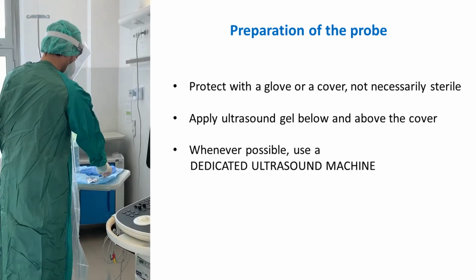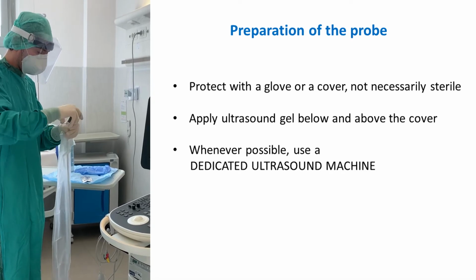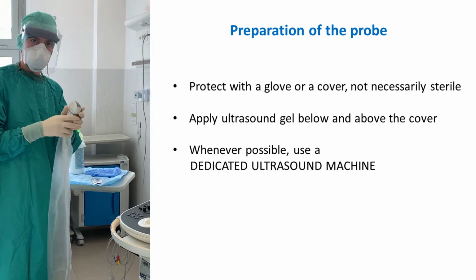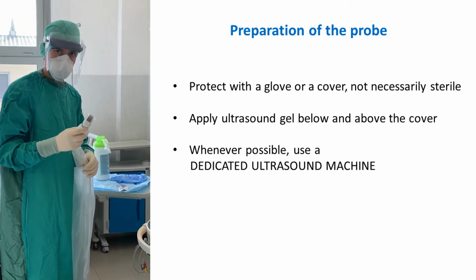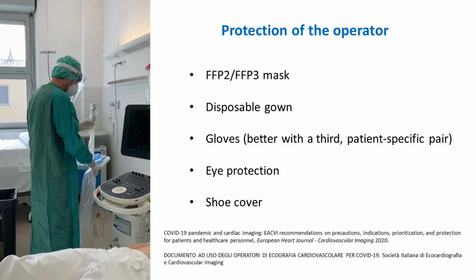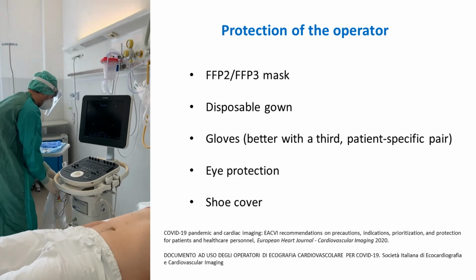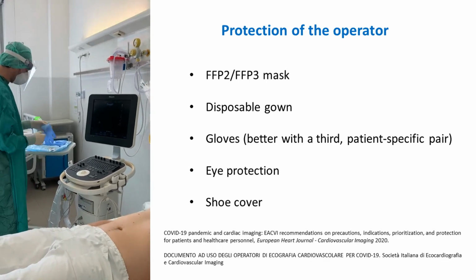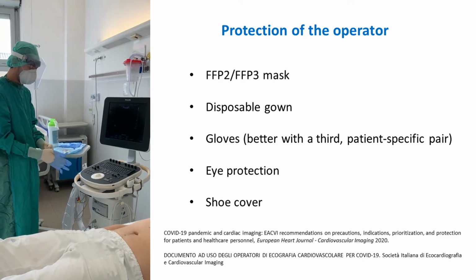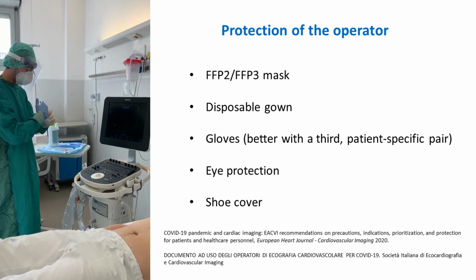Whenever possible, a dedicated machine should be devoted exclusively to COVID patients to minimize the risk of spreading the infection and to simplify cleaning procedures. The operator should be properly protected, as indicated by recommendations and specific documents. To protect the operator, it is advisable to use a third pair of gloves, which will be discarded at the end of the exam.